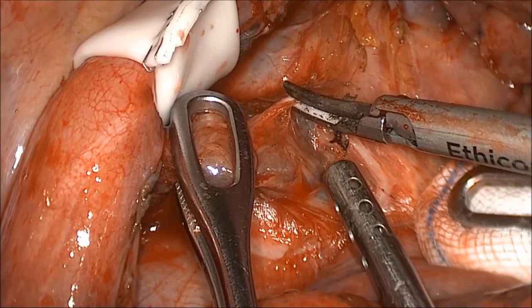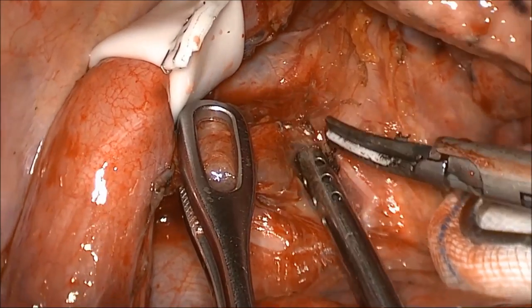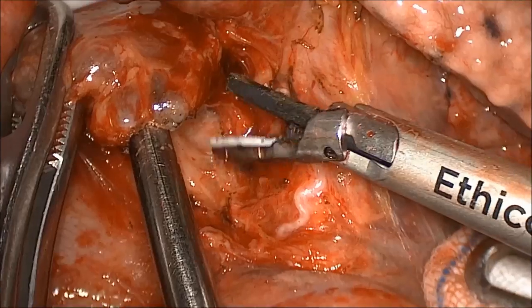A lymph node dissection is completed according to the patient's pre-surgical imaging and workup. Typically, level 7 subcarinal, level 8 paraesophageal, and level 9 pulmonary ligament lymph nodes are taken.